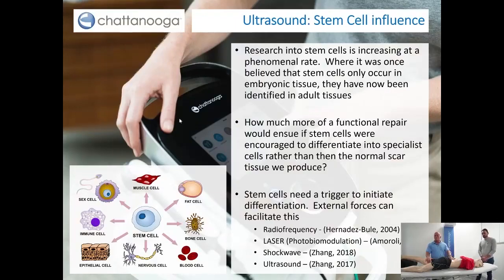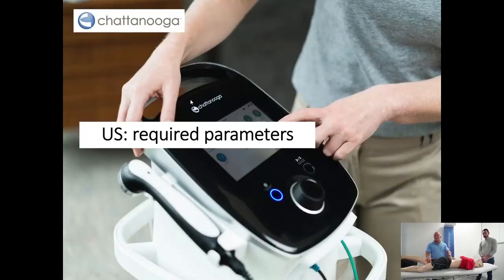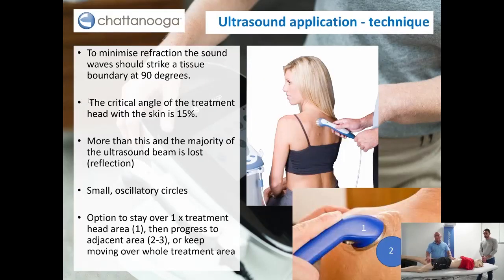Let's look at the parameters now, things like our dosages. Before we treat our dear old Fred's OA knee here, we need to make sure we're going to apply things correctly. We spoke with radial pressure waves that sound waves love travelling through water.